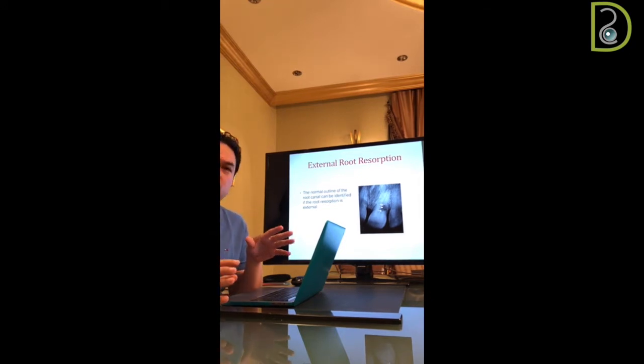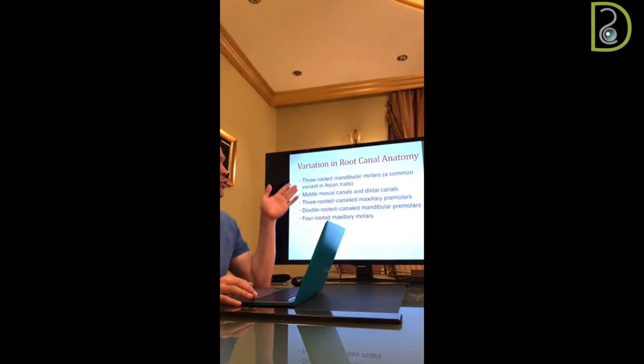So if you want to differentiate between internal and external: if there is disturbance of the root canal system, that means it is internal. If there is no disturbance of the root canal system, that means it is external.